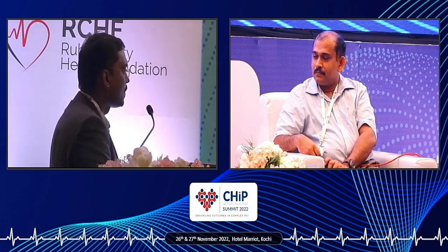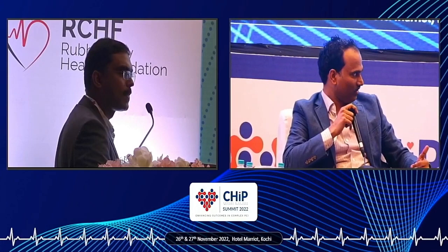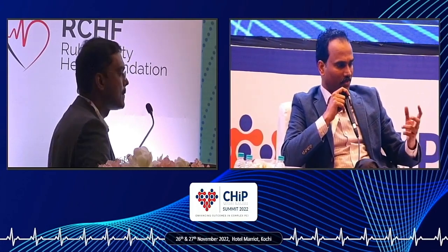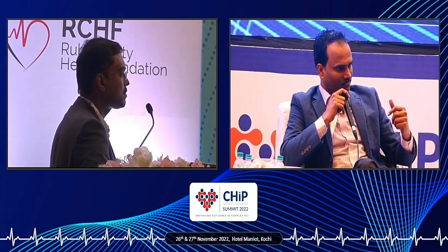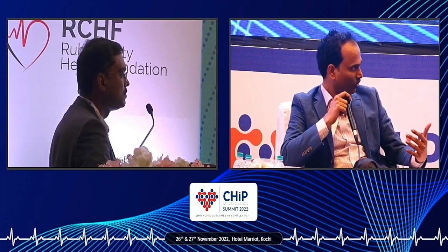I'll add a couple of things. You asked about when to select laser in such situations. It's again based on the pathology. If the pathology is predominantly intimal hyperplasia, then I think that's where the laser comes as a rescue.